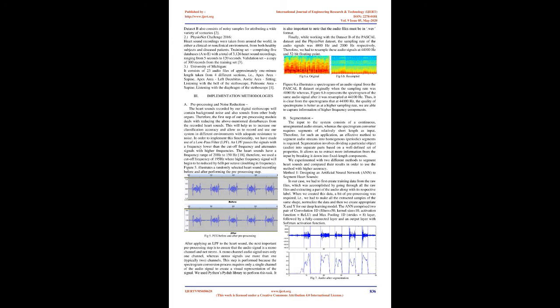This step is performed because the spectrogram conversion process requires only a single channel of the audio signal to create a visual representation of the signal. We used Python's PyDub library to perform this task. It is also important to note that the audio files must be in .wav format.